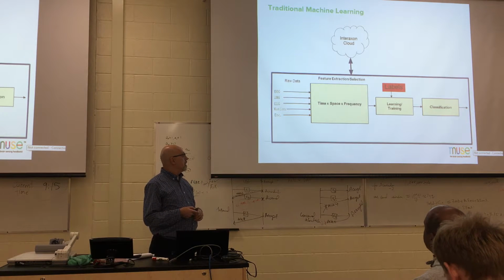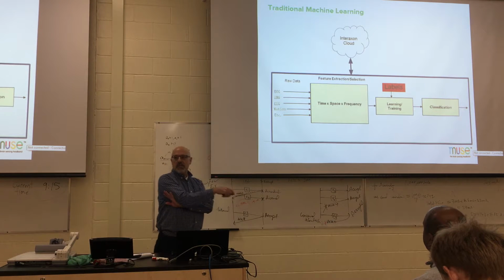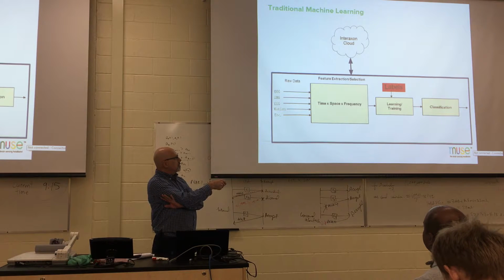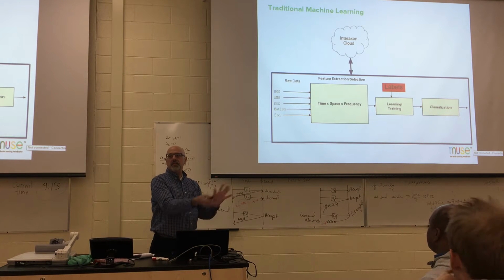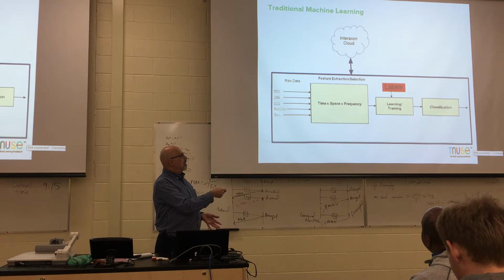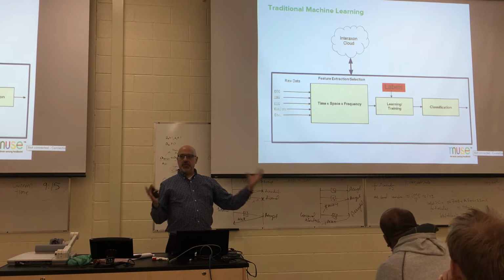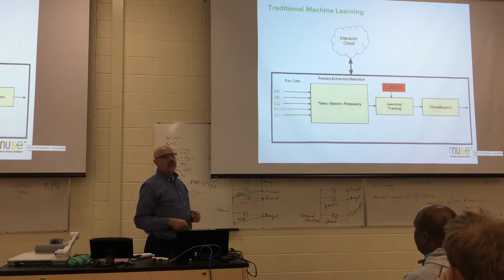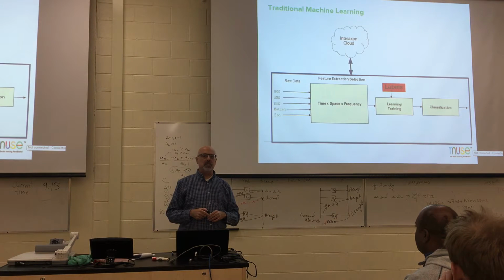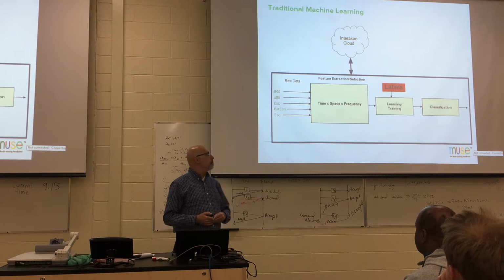The ECG can contaminate and get all the way up to here, and you can see heartbeat as a contaminant in the signal. So what we want to do is extract features from these streams of time series data to help us recognize when this is clean EEG versus when there's a contaminant in it. We look in the time domain, at spatial features, in terms of where the signal is coming from, and we're also looking at frequency information. And as I introduced, there's a lot of interesting information in the signal when you analyze the frequency components of the electrophysiological signal. Okay?